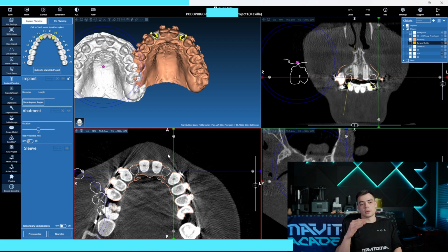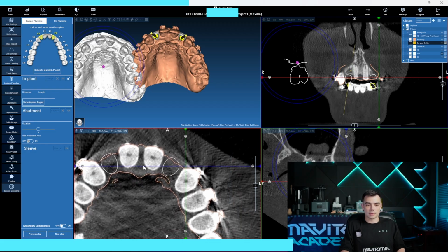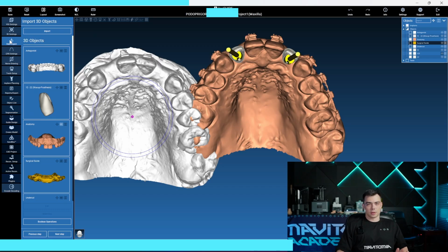And again, don't be relaxed, since you have obtained this aligned data, like CBCT and scans, on the same day, because time goes every day. And when you have received such data, you have to plan your guide as soon as possible. Okay, I think you have realized it, understood it.